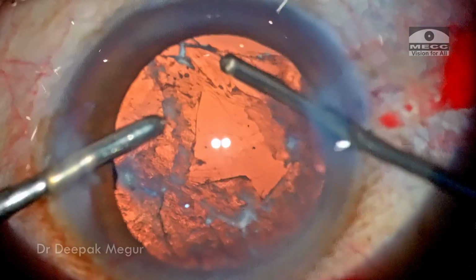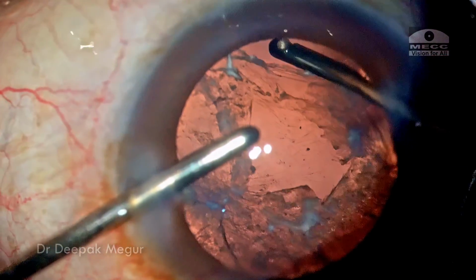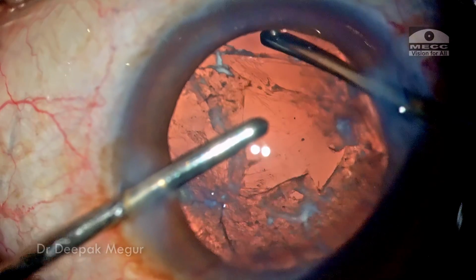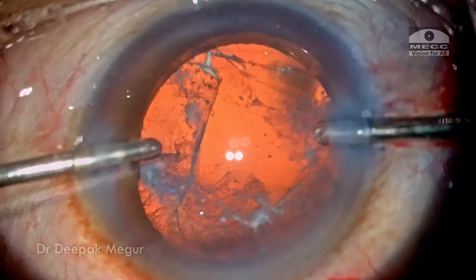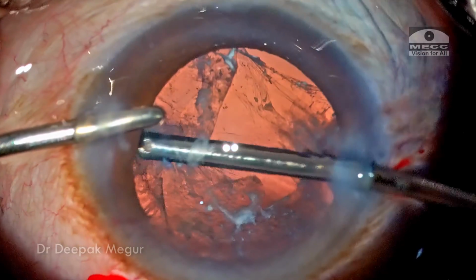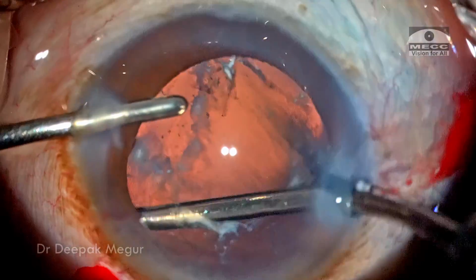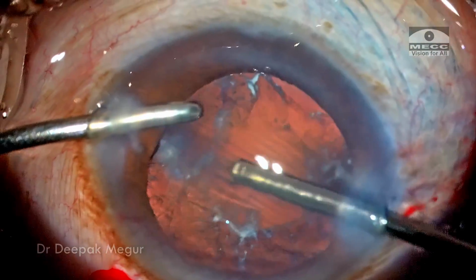So once the vitreous is taken care of, we can see that the capsular bag just falls back to its original position. With the vitreous out of the way now, again I switch to my bimanual I&A and go back to teasing out this thickened cortex which is there in the remaining part of the capsular fornices.